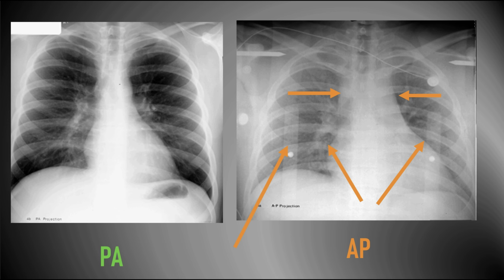The best time to take a chest x-ray is during inspiration. Now, if you have a patient down in the x-ray department and you say, take a deep breath in and hold it, it's very easy. In the ICU, it's all about timing, and a lot of the bedside practitioners don't know how to put on an inspiratory hold. So it's a bit of a lottery whether you get an inspiratory or expiratory film.